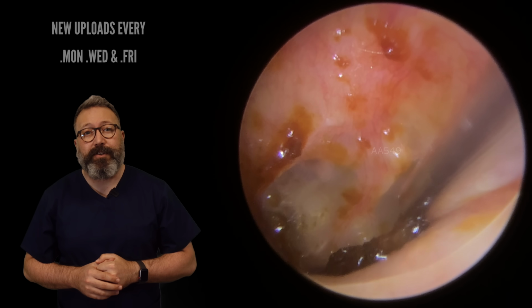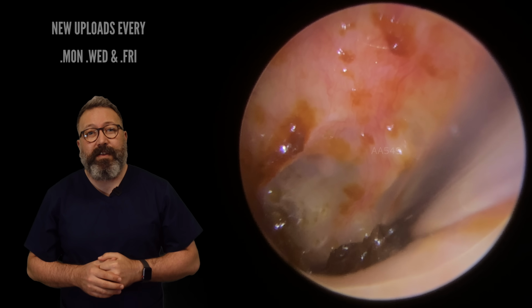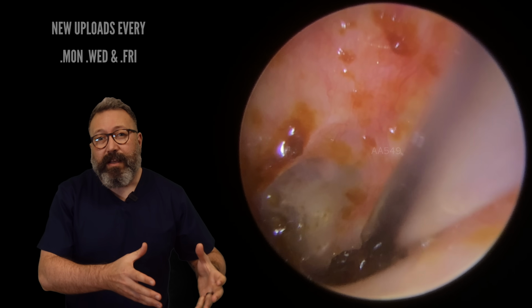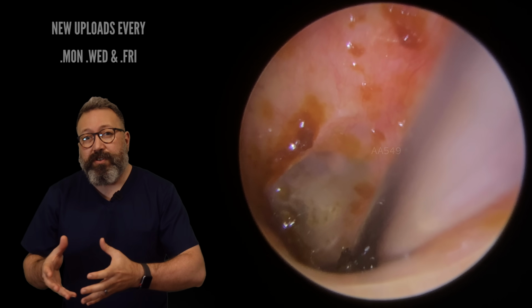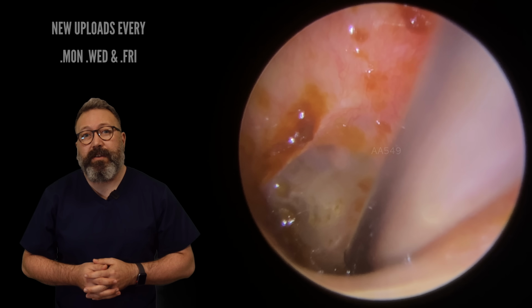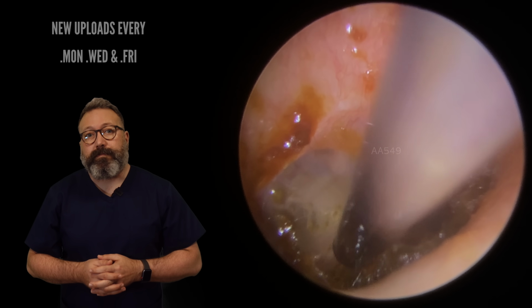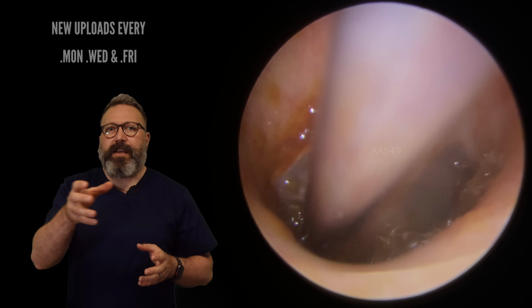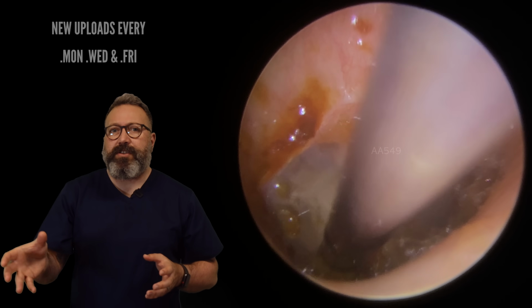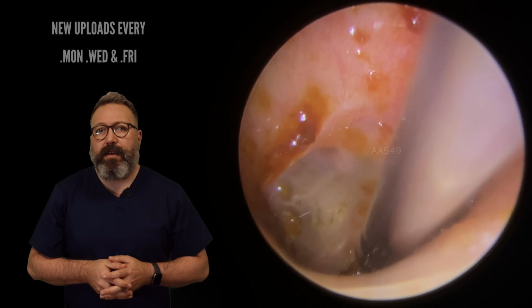Let's get this next section. There we go. You can see it hovering just in front. Now we're going to try and get a good grip and draw across again. Gosh, there is so much down in here. As I got a grip on that section, I could see this section to the left-hand side just starting to lift. So let's concentrate on that. Oh, there we go. That's good. That's come away really nicely.